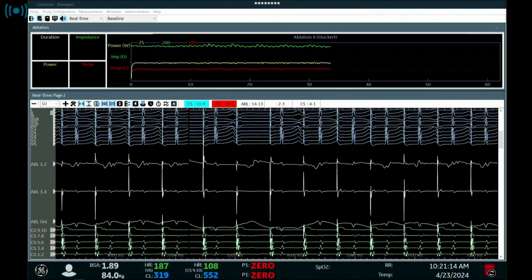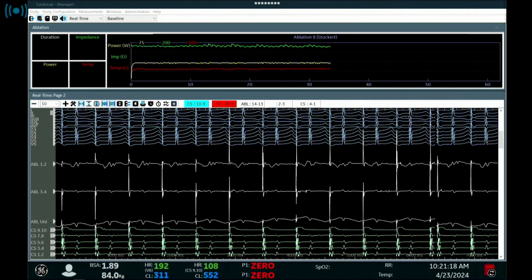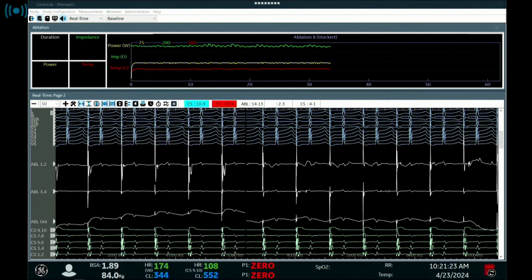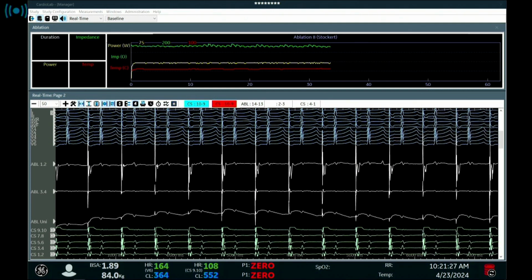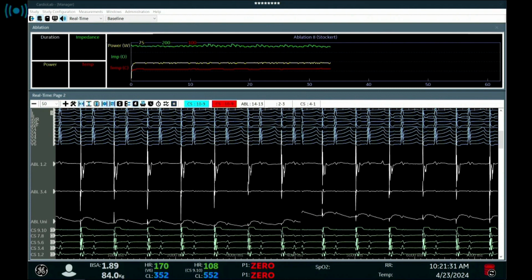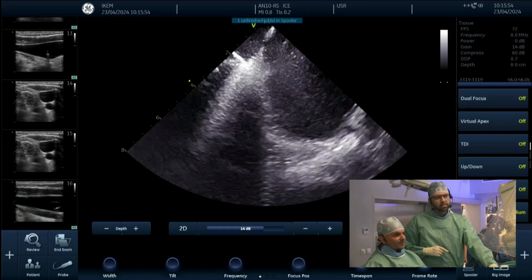If you do it just with X-ray, you are happy that you go through, but I agree that you can go with experience, but you can never be so selective as with ICE guidance, and you can never be so safe, because you know exactly what you are doing. But this is just one part of using ICE, as we could see in the repeated examples.